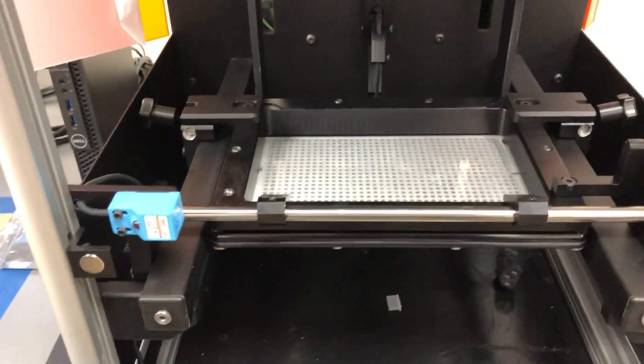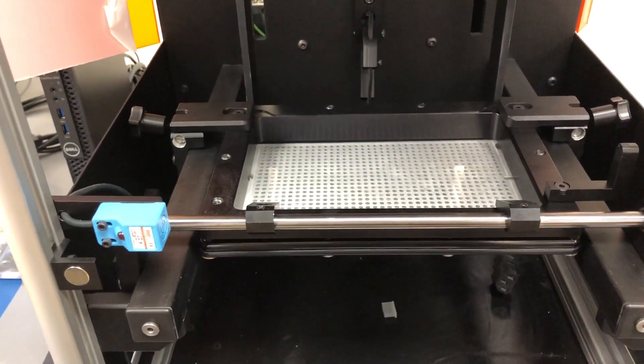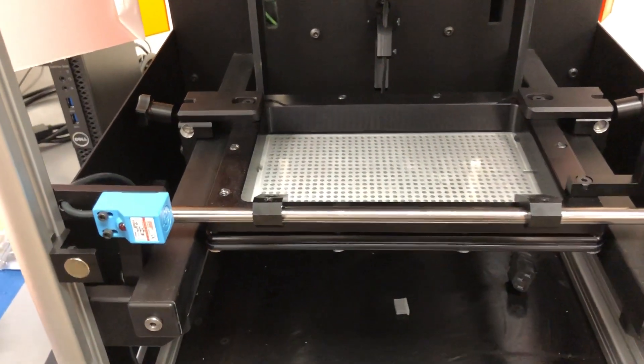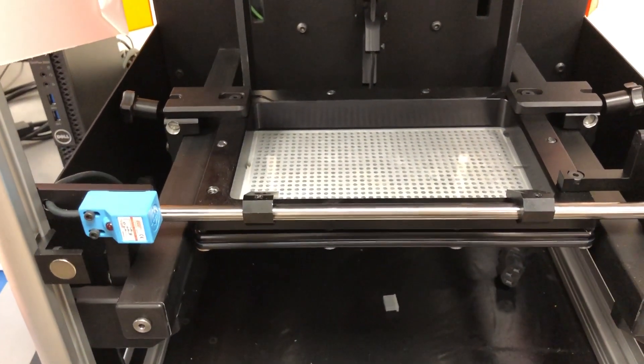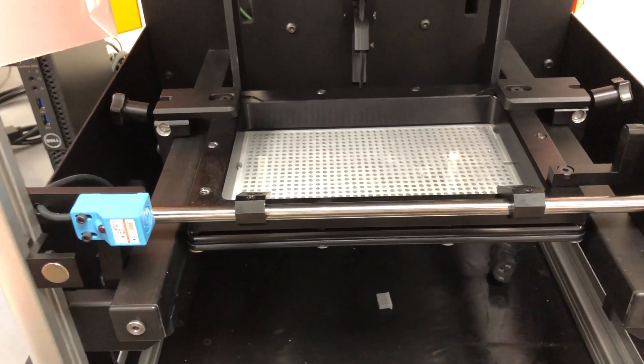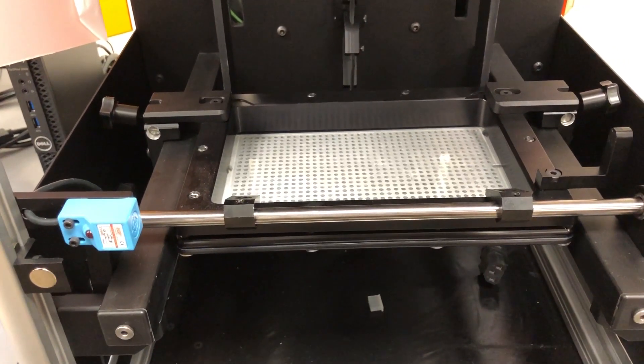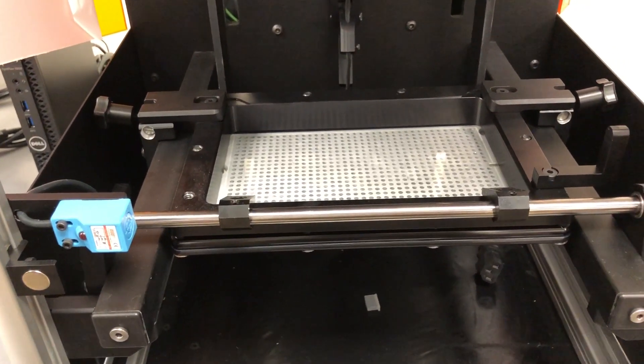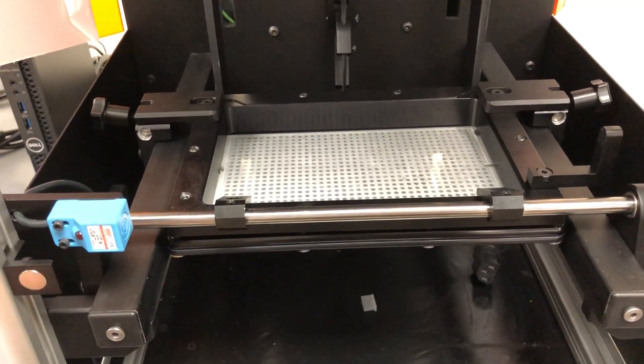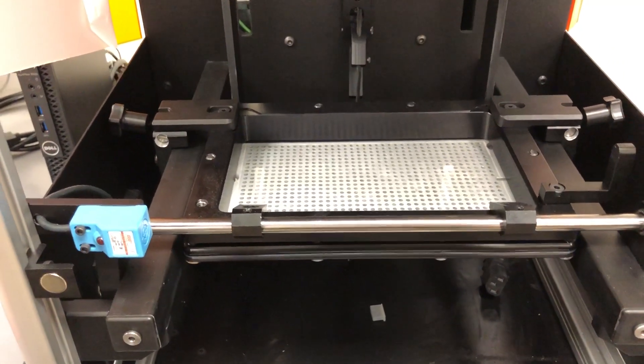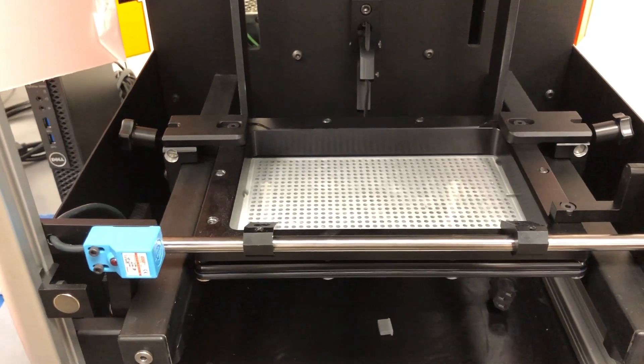This is the position that the printer will be in when you need to lift the Z-axis up out of the way in order to insert your resin bat.